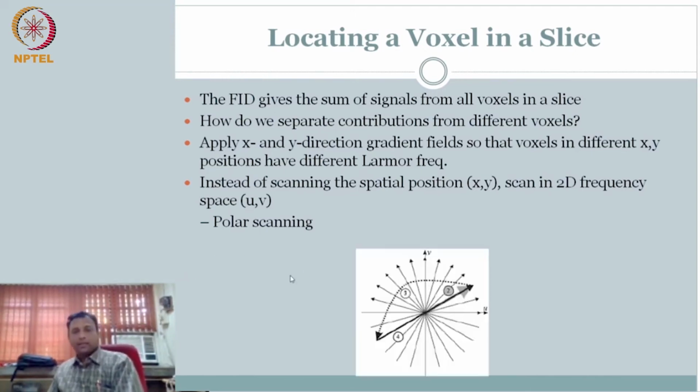One is polar scanning, where you essentially rotate. We saw a U here in the previous sequence. By applying one particular gradient Gx, we got along this. If I repeat this experiment multiple times, perhaps I can repeat it with different values so I can manipulate. So that is one, polar scanning.